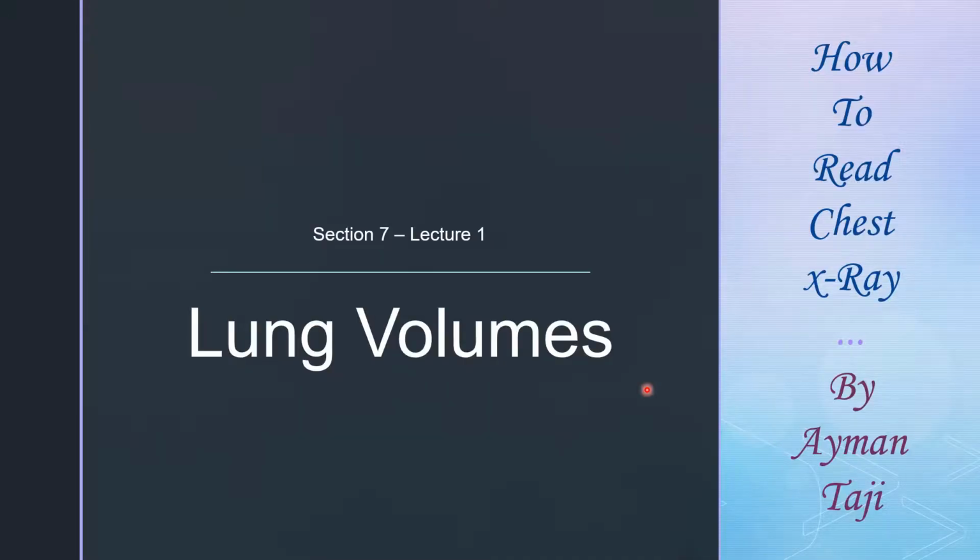Welcome to the seventh and final section of this course. In this section, we'll discuss lung field abnormalities on a CXR, and in the first lecture, we'll start with the first step in assessing lung fields, which is assessing lung volumes, if they are increased or decreased.